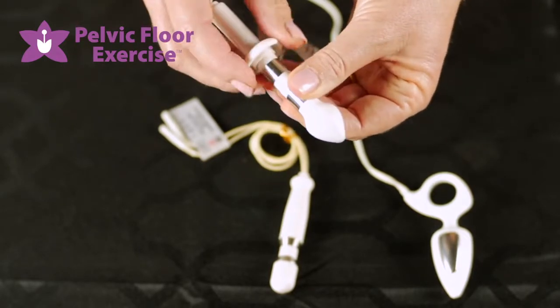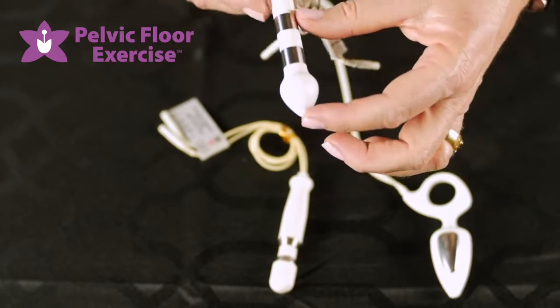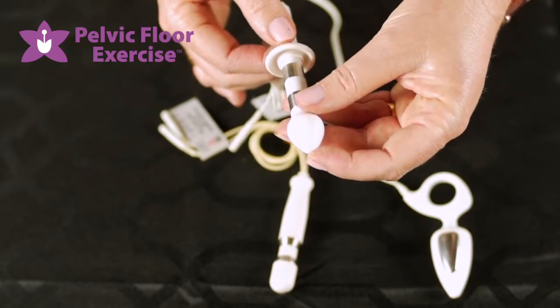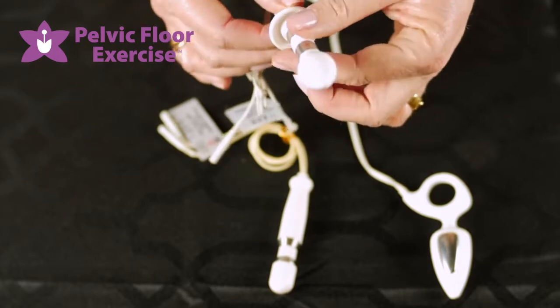The 12 mm probe also has an adjustable collar. Everyone has a slightly different size, so once you find the comfortable insertion length with this one, you can actually adjust where that is using the collar. For future treatments the patient knows that's as far as they need to insert the electrode.